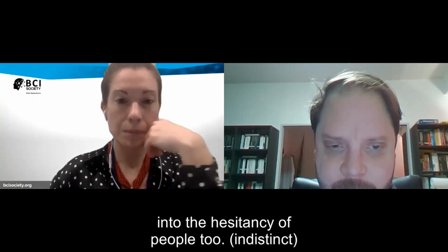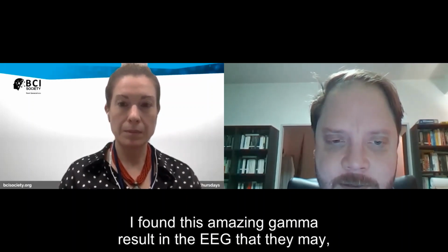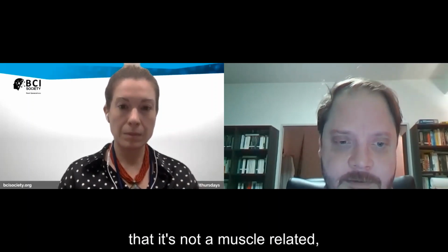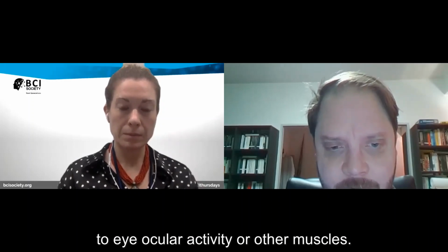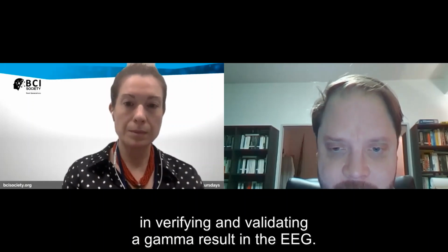So that could play into the hesitancy of people to accept a new result, saying I found this amazing gamma result in the EEG. You need to make sure that it's not muscle related, and not in any way correlated to ocular activity or other muscles. So you just need to be extra careful in verifying and validating a gamma result in EEG.